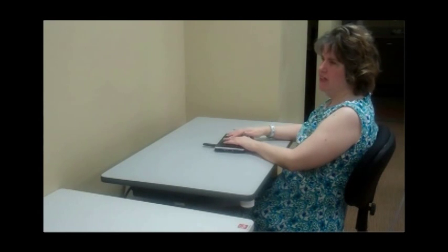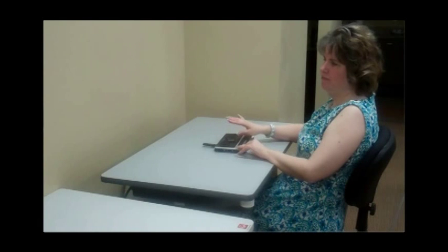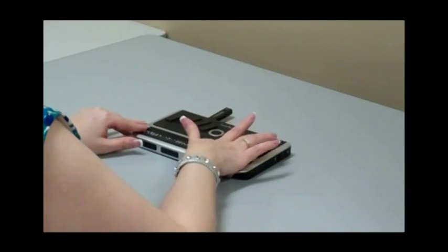And what we're going to do here is we're going to set an appointment. So I'm going to bring up a menu for the application. Appointment menu. And we're in the appointment menu. Schedule an appointment. Schedule an appointment, that's what we want. So we're going to press enter on that.